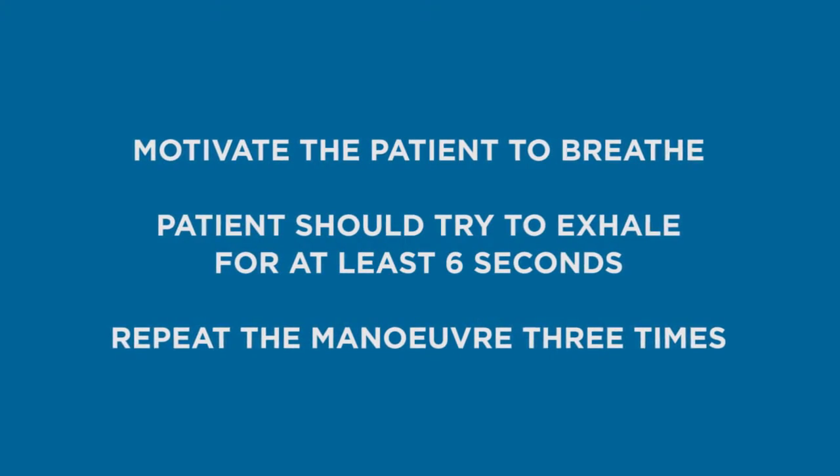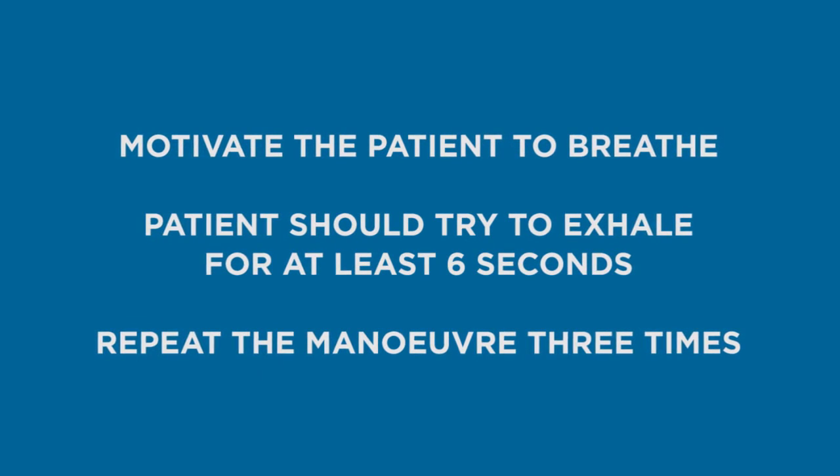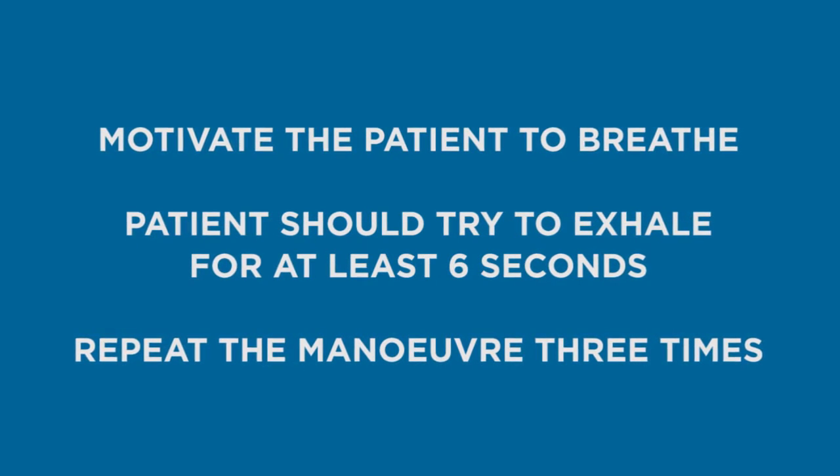The physician should motivate the patient by saying, keep going, a little longer. The patient should try to exhale for at least six seconds. Repeat the manoeuvre three times.